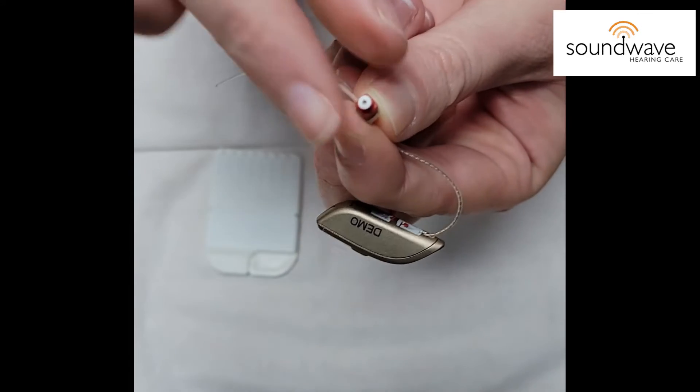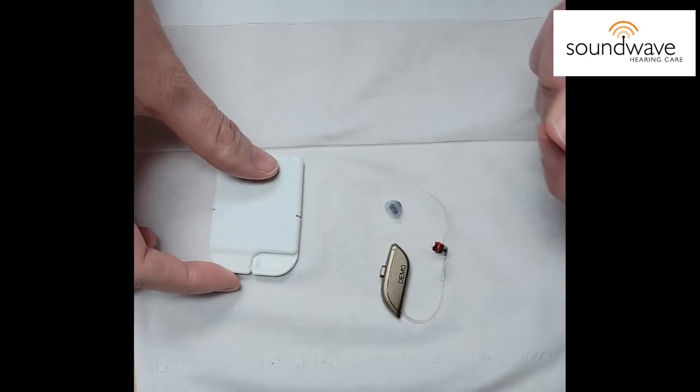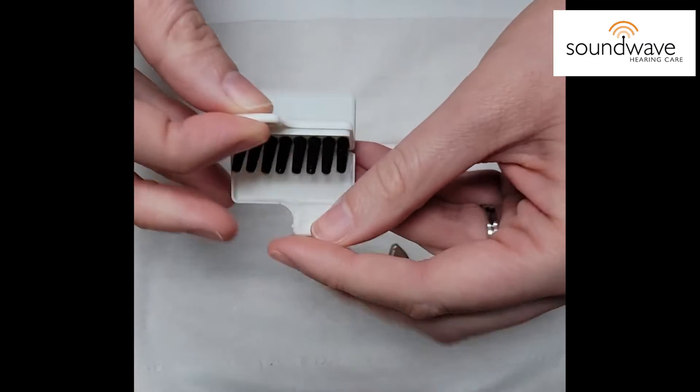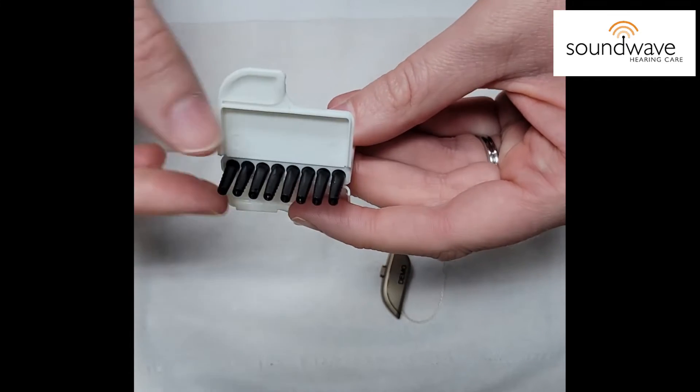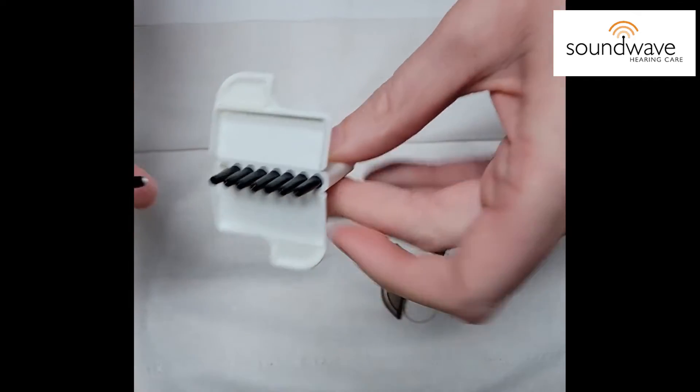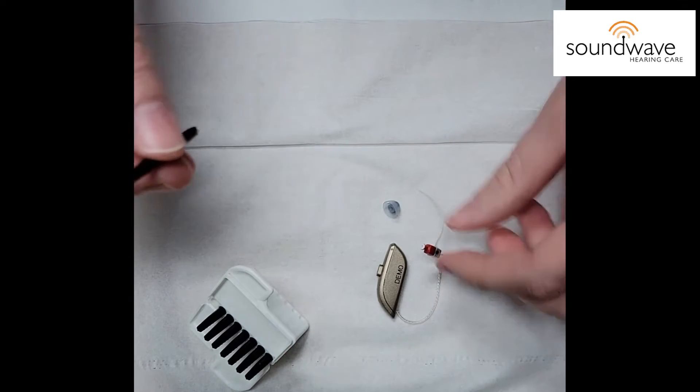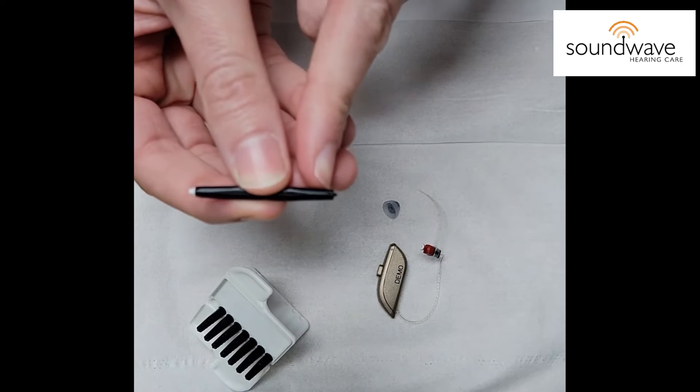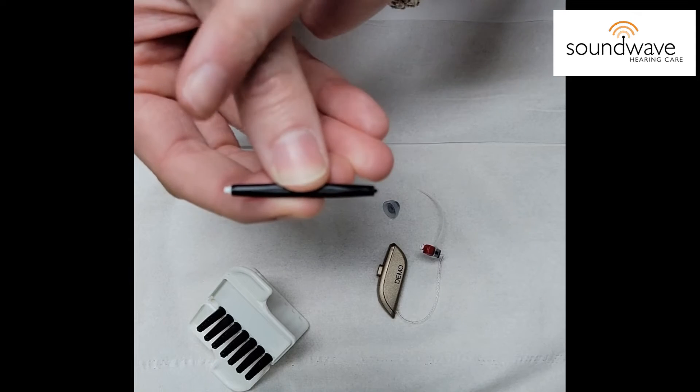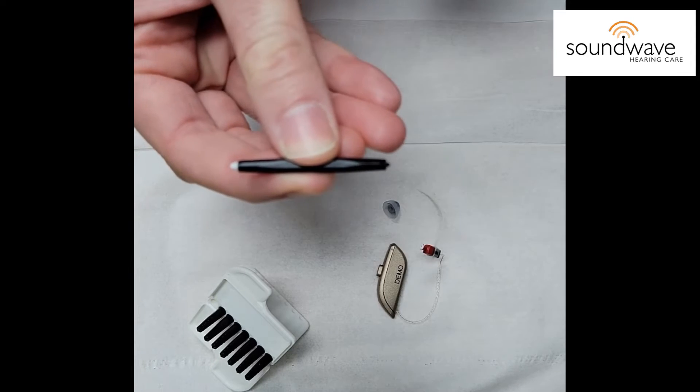So to replace this you're going to take your wax guards and here you have some replacements. You're going to just take one of these little black sticks out of the case and what you may see is a little sharp end on one side and a replacement filter on the other.